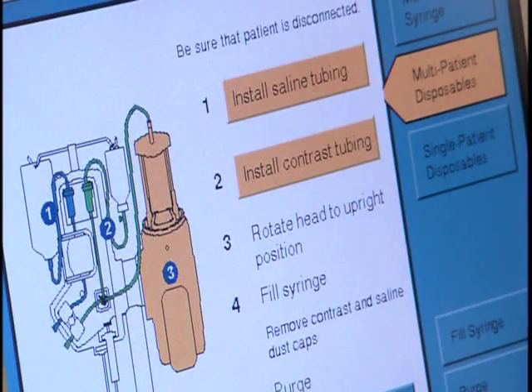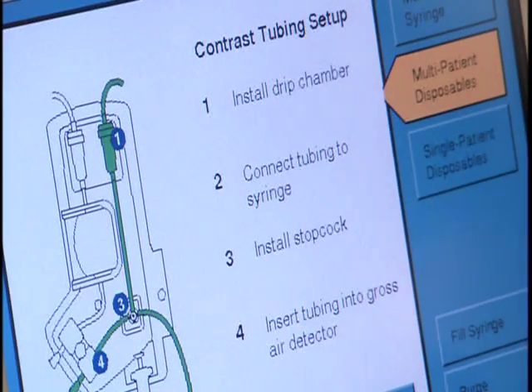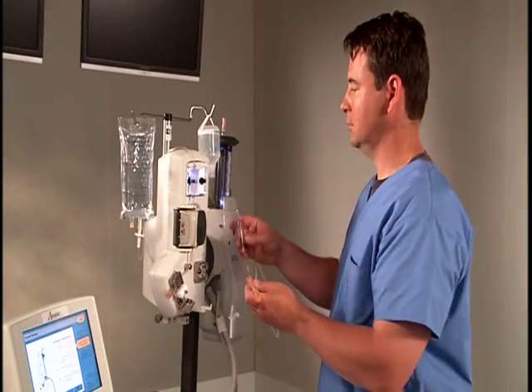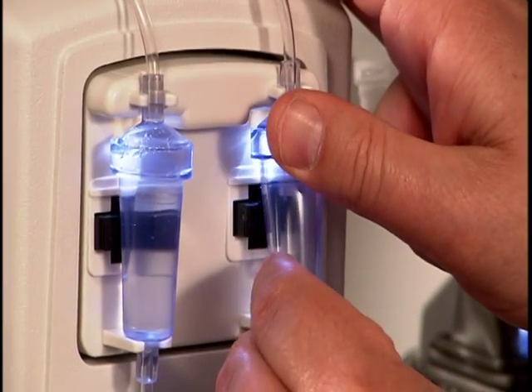A graphic representation of installed disposables is displayed. Next, touch Step 2, Install contrast tubing. Note the graphic representation of the flow control module and the contrast tubing setup with a list of numbered actions below. Perform the following contrast tubing setup instructions. Step 1. Install the contrast drip chamber.